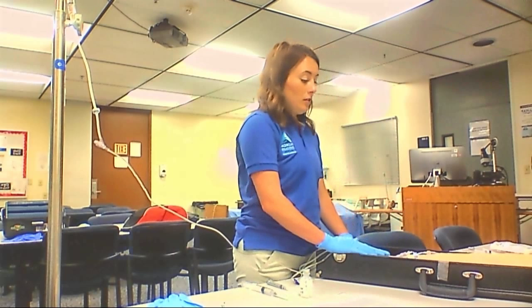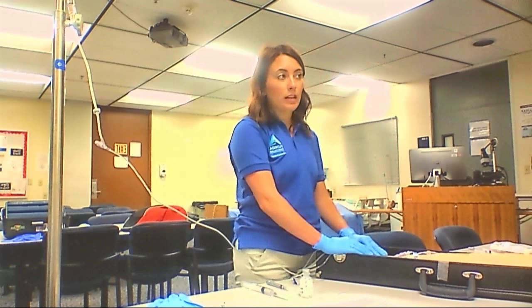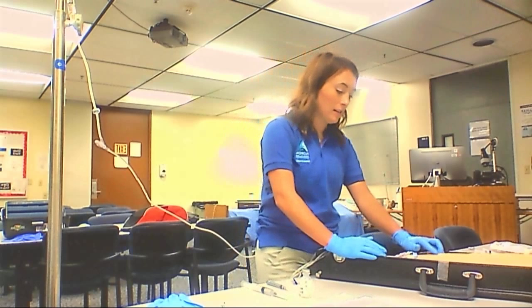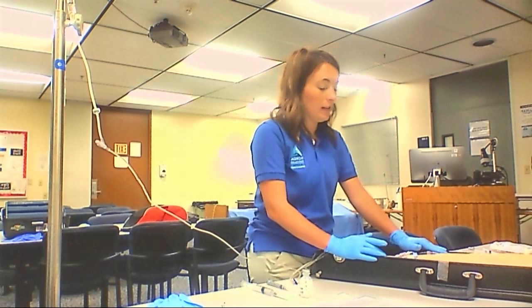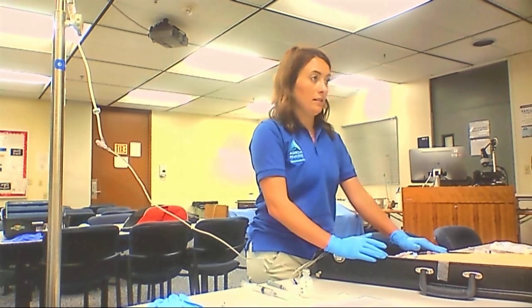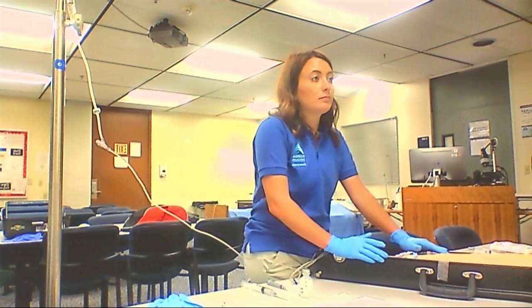I have also explained the procedure to the client, as to why the medication has been ordered, and educated them properly. Again, double checking that the patient has no allergies. I want to make sure that the patient has no obvious signs of infection or phlebitis. You want to make sure that there isn't any infiltration of the IV itself.